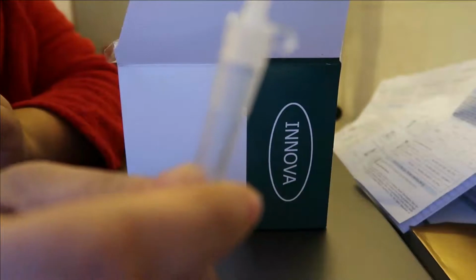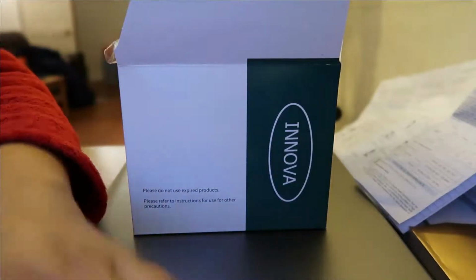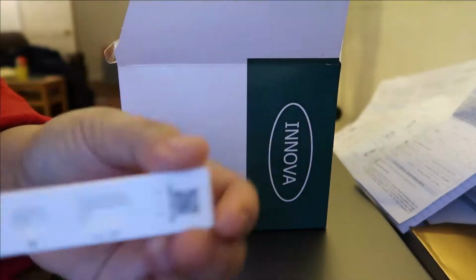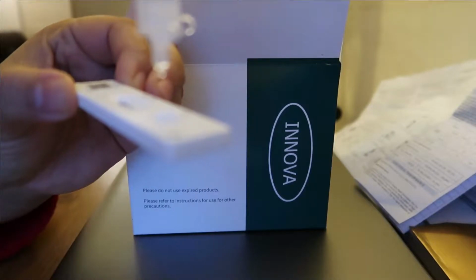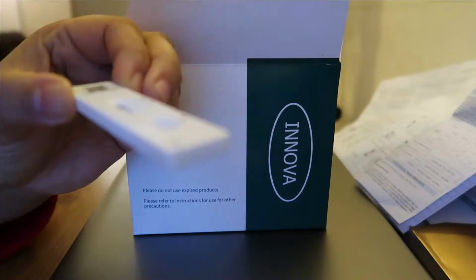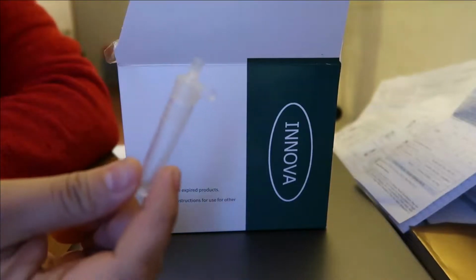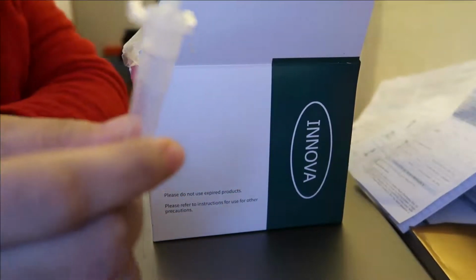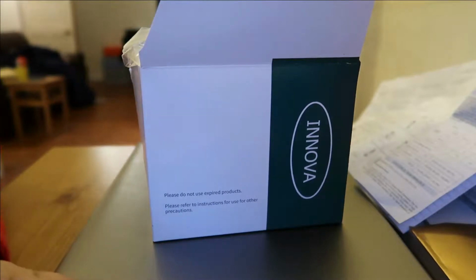Okay, then load 2 drops of extraction solution into the sample well of the test cartridge. Remember our test cartridge, so I'll put it on the S part. S, can you see? So 2 drops, 1, 2. Basically you don't need this anymore. You can throw this away. There is still some liquid inside, but you don't need it anymore. Okay, read the results at 20 to 30 minutes. As you can see, it's starting to read.